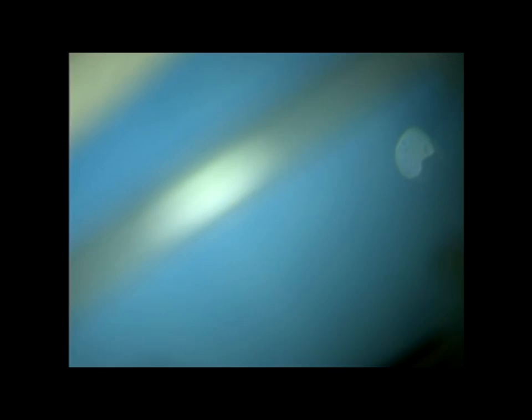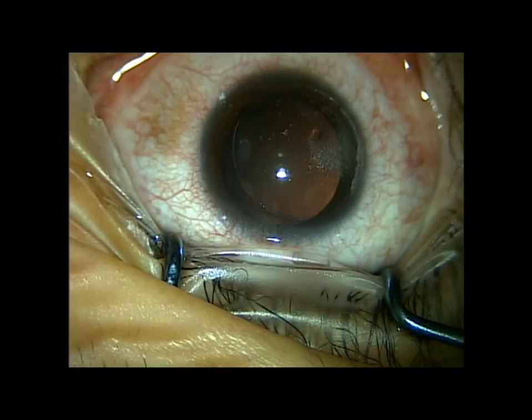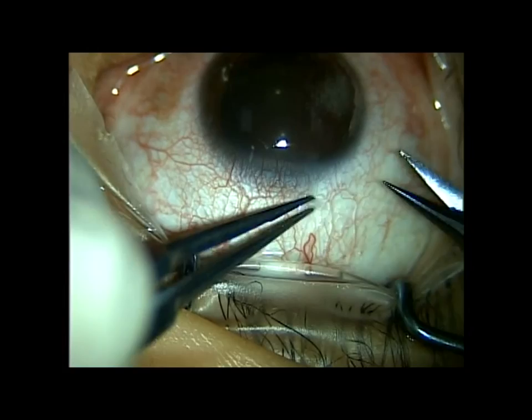Now I've got my hydrated foam tip soaked in balanced salt solution. I crimp the leading edge of the cartridge, push it back until it goes into that lock-and-key position, rotate it into the notch, and then set it aside and soak it in BSS. Here's the eye — I've already made an intralase flap, but I did not lift the flap. You'll see on the three o'clock position some bubbles from the intralase flap.